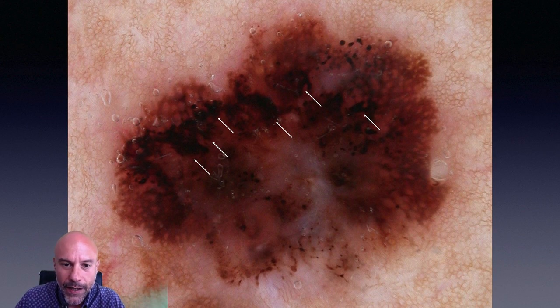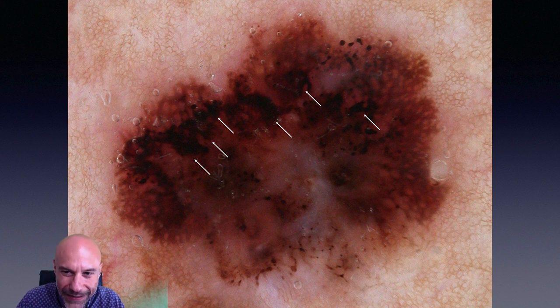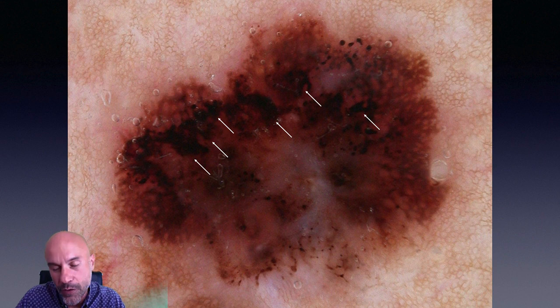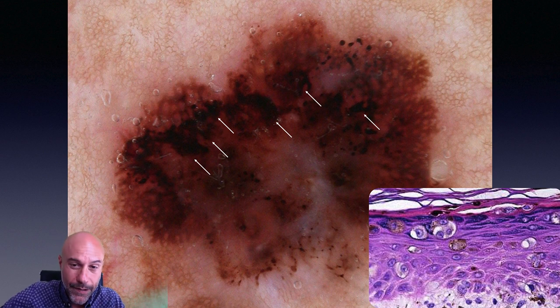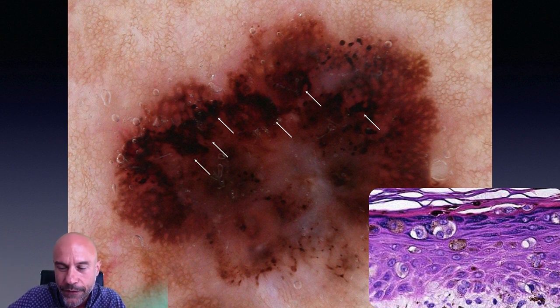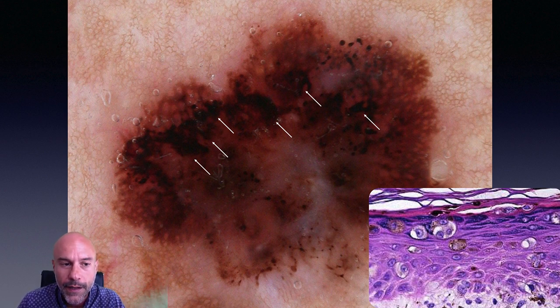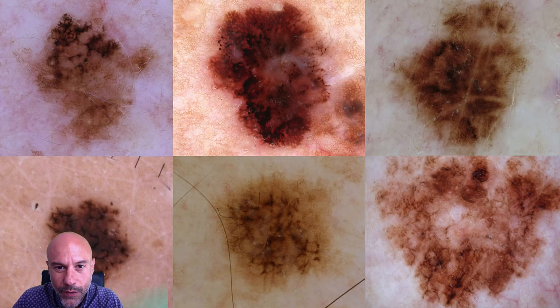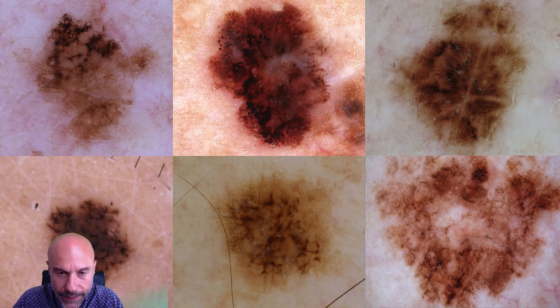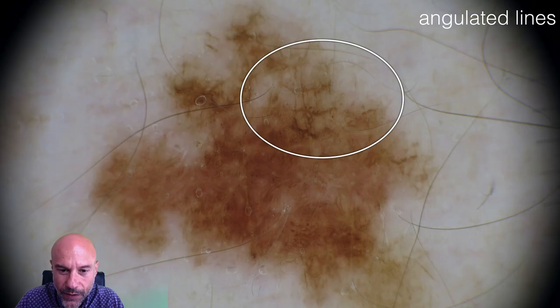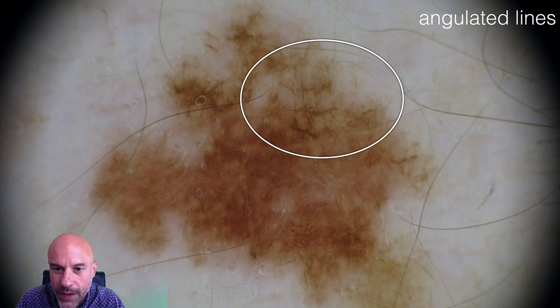Irregular hyperpigmented areas are small, darkly pigmented, almost black, irregular in shape areas of the lesion that very possibly correspond to the upward migration of melanocytes within the epidermis — that is why they are black in color. This phenomenon of upward migration probably corresponds to the so-called pagetoid spread, which is an important histopathologic criterion of melanoma. This panel shows multiple versions of these irregular hyperpigmented areas.